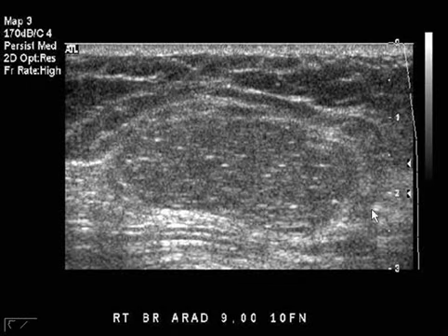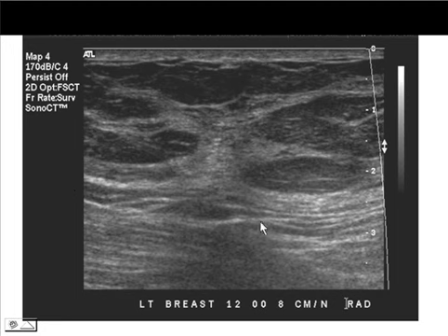Here is an example of a lipoma, but fatty lobules on real-time scanning can interlace and interbraid, and they don't have abrupt interfaces with the surrounding tissue, and that's how you can tell they're fatty lobules. So I can't overemphasize the importance of real-time scanning with breast ultrasound. Looking at static images is really just not enough. You really need to go in there sometimes.